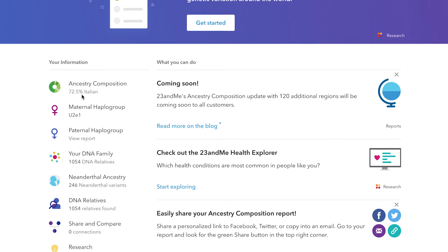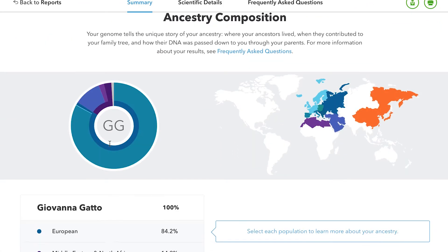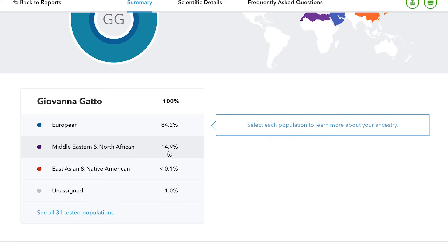So as you can see right here it says 72.5% Italian, so I am still Italian for the most part. But if we click on this it will load and you can see the full breakdown of all of my DNA. So that's me — I'm 84.2% European and 14.9% Middle Eastern and Northern African.